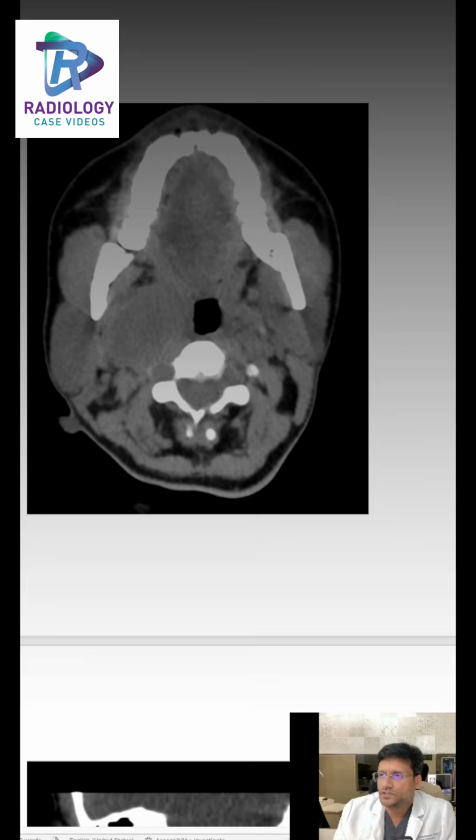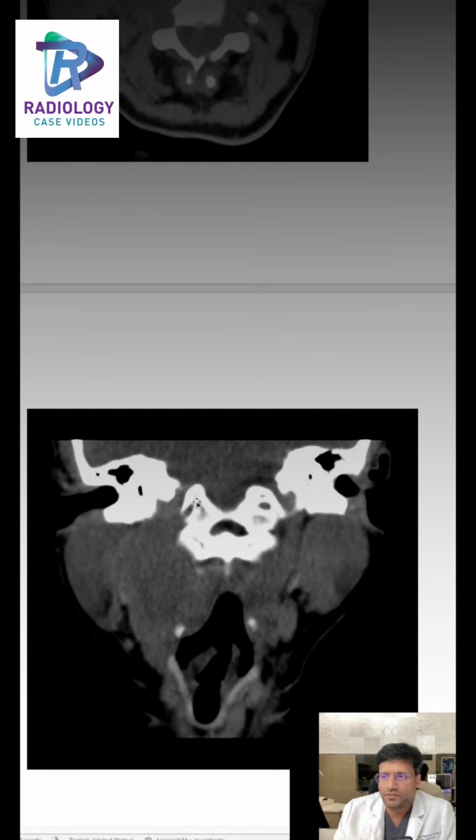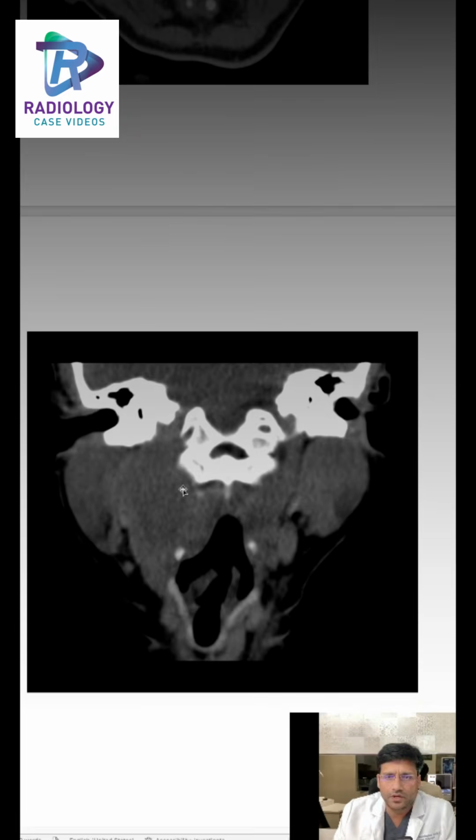Incidentally, a CT scan was also performed. The patient didn't have any calcification. Again, the widening of the foramina was very well seen on the coronal image.